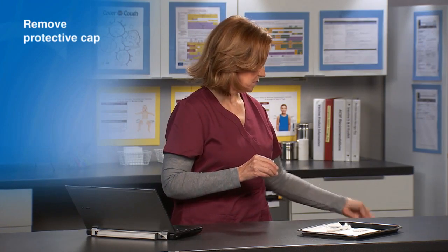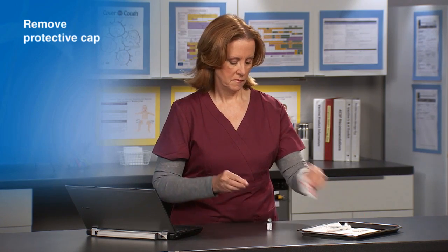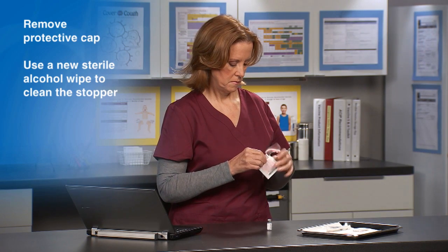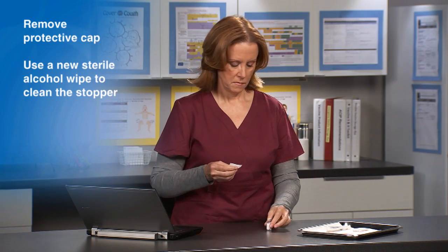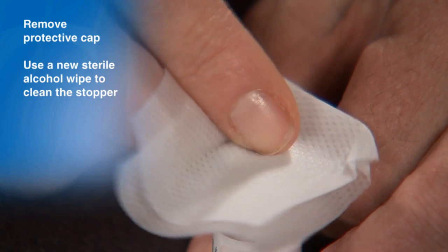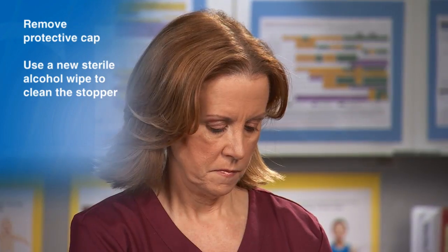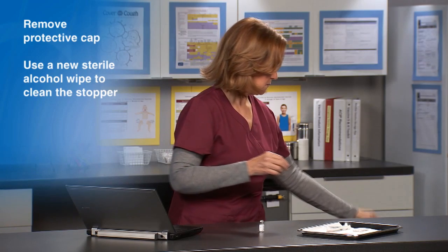Remove the protective cap from the vial. Use a new, sterile alcohol wipe to clean the stopper on top of the vial. Do not rub the stopper vigorously, as this can move bacteria from the uncovered rim of the vial to the stopper.